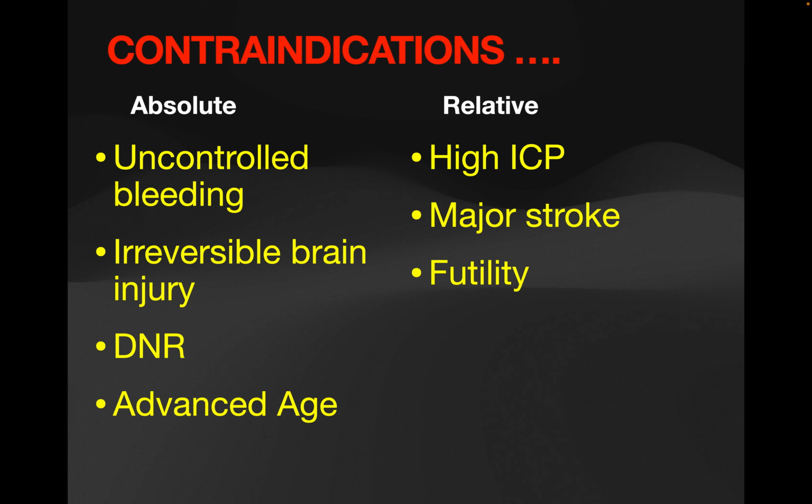So the contraindications are, of course, the absolute contraindications, which include uncontrolled bleeding, irreversible brain injury, when the patient is not for resuscitation, and advanced age. You need to refrain from putting these patients on ECMO.